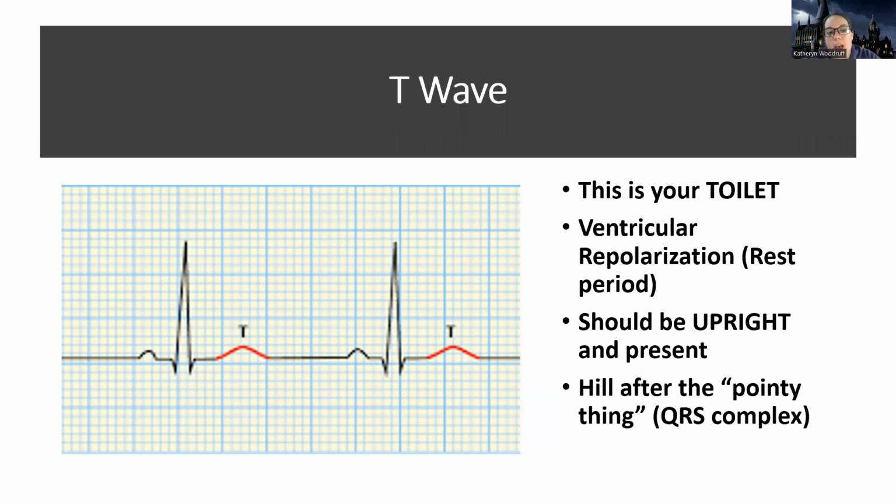The reason I call it the toilet is because someone explained this to me once when I was in an EKG class and it makes total sense to me: your T wave is the time your heart's supposed to be resting. So think of it like when you flush your toilet, and let's say you need to flush twice because maybe you used some extra toilet paper. You flush the first time and you're waiting for the toilet to refill. This is what the T wave is. It's like waiting for the toilet to refill.